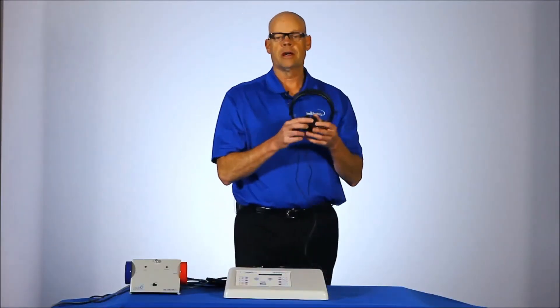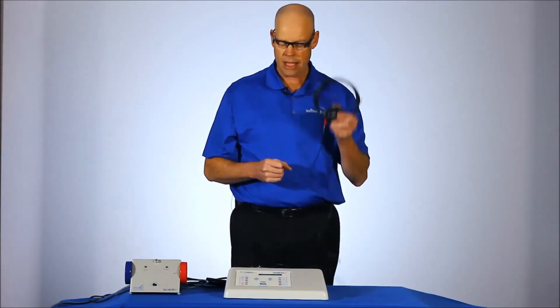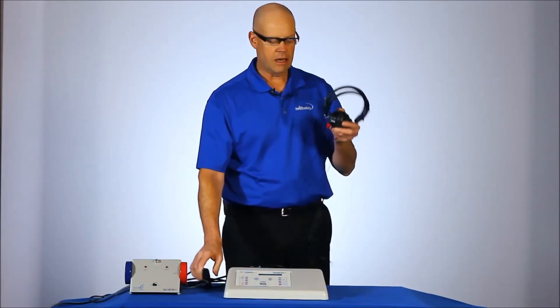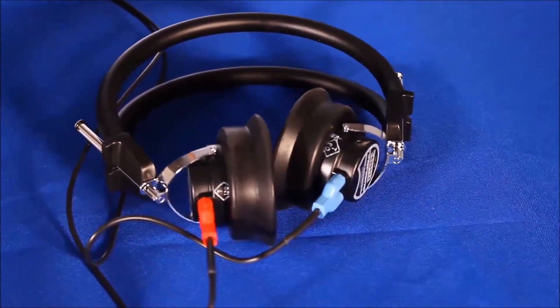The audiometer comes standard with a pair of TDH-39 headphones as well as a patient response button. Like any audiometer, the red is always your right side or right ear.